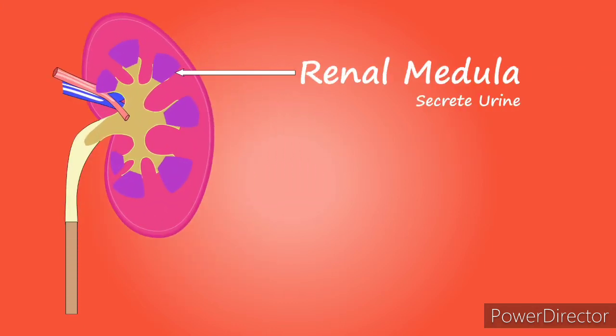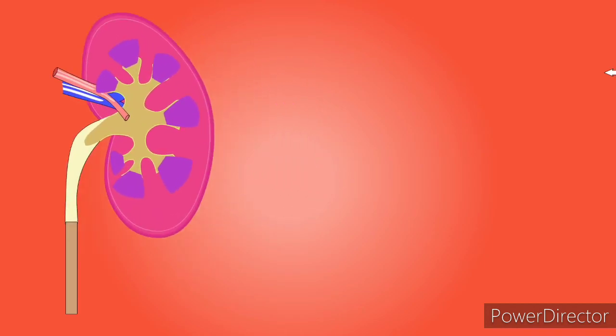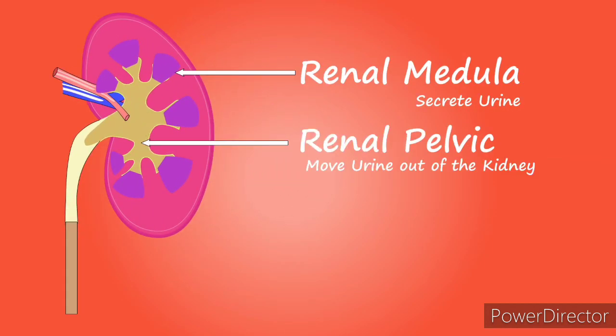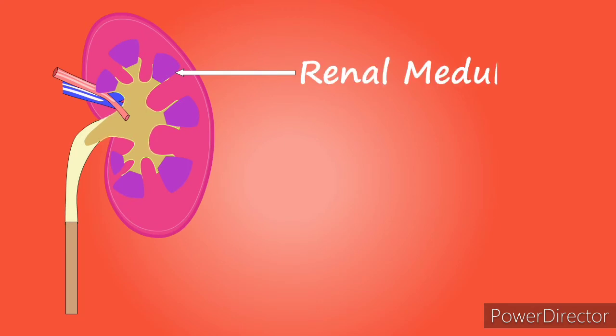You have to check if there is red blood cell in that urine. You have to check for white blood cells. You check out for epithelial cells, casts and bacteria. So today I'll be explaining more on the physical examination of the urine.